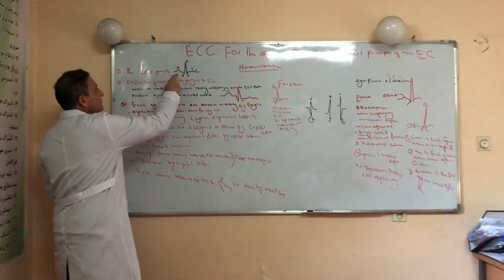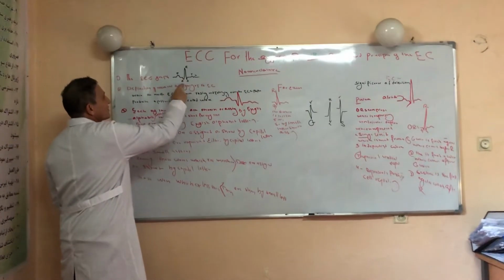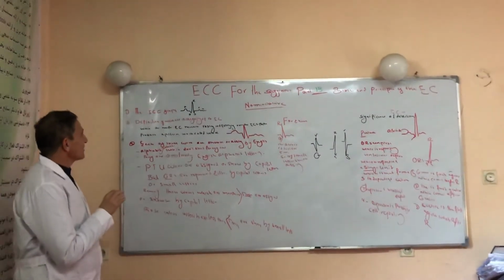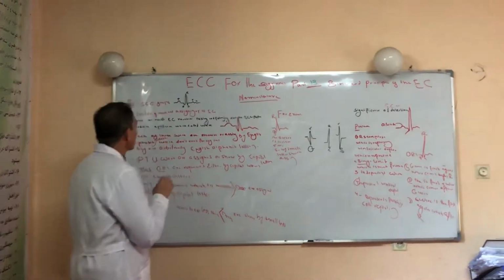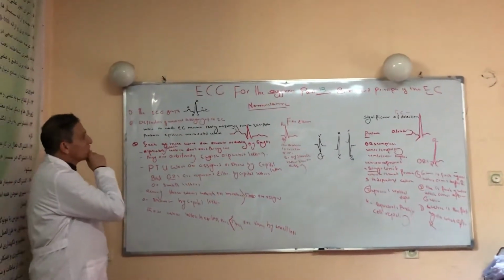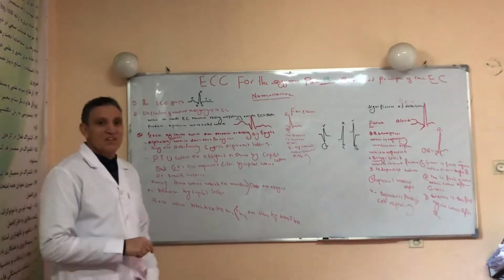This is the first wave, that is called the P wave. After the P wave, another small wave is called the Q wave. So, a series of the waves or deflections of the ECG graph seen during one cardiac cycle. Under the topic of this nomenclature, after the ECG graph, we will be discussing the definition of the waves.